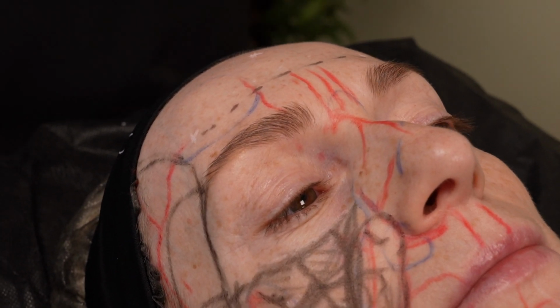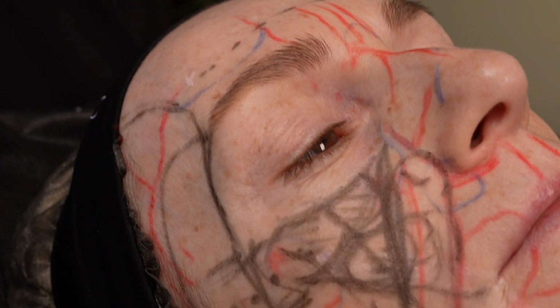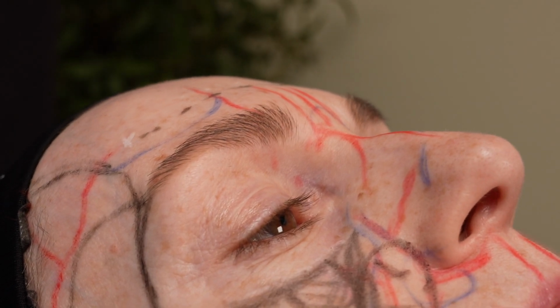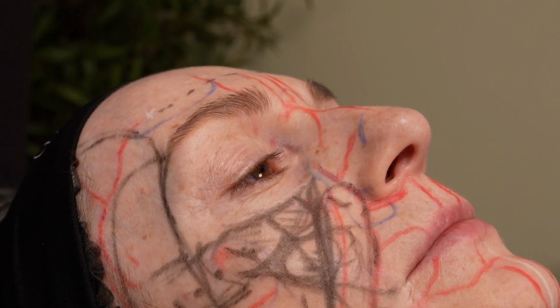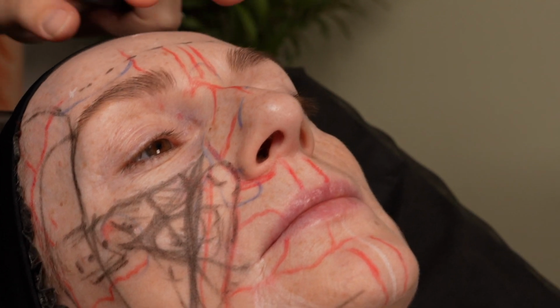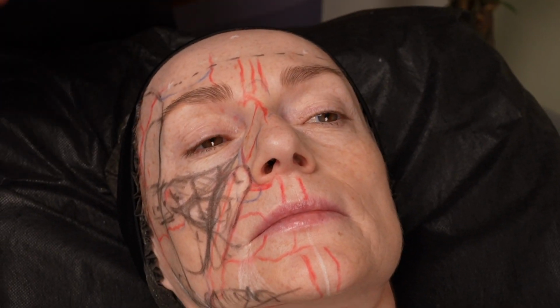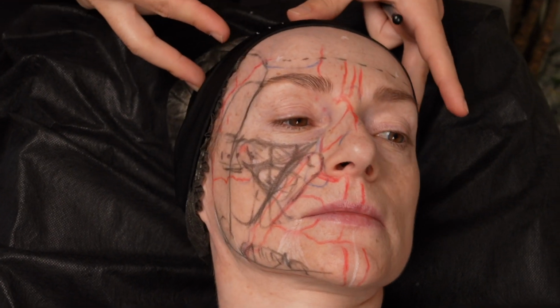You cannot even move your cannula within your injector. Yesterday I showed, when I put my cannula inside this tissue and left it free, my syringe stayed stable. It's that tough and hard a plane. So it doesn't matter how many openings you make, but underneath this galea, the deep injections are always safe in the forehead area.